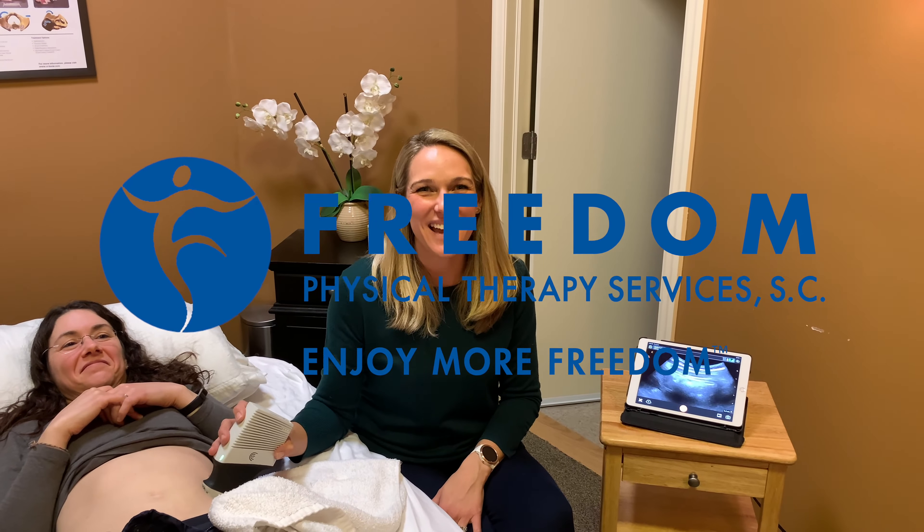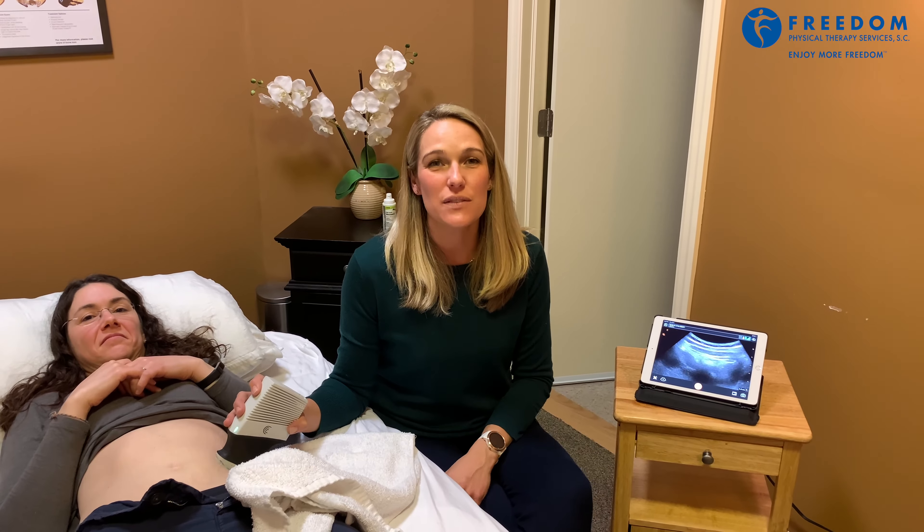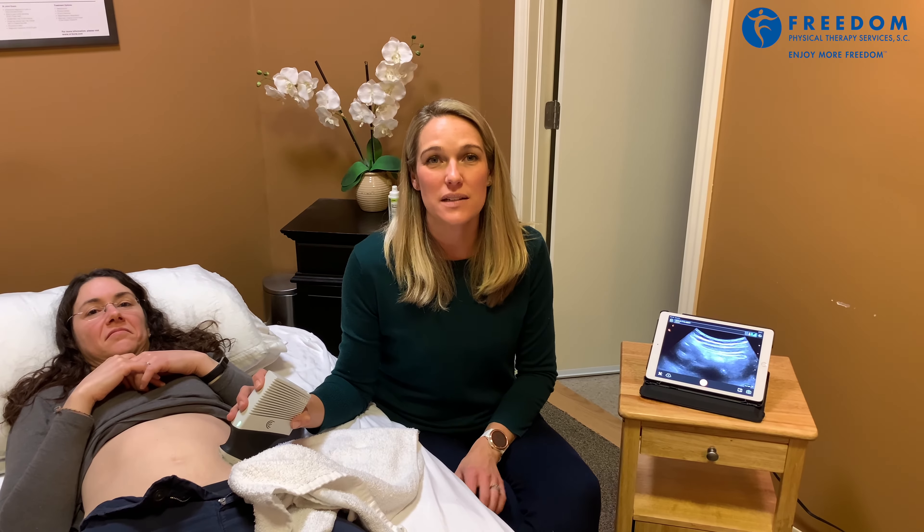Hi, Nina Olson here again, and today we are talking about real-time ultrasound. We're using it for a muscle group called the transverse abdominus, which is a deep muscle of your abdomen — the deepest muscle of all your abdominal muscles.